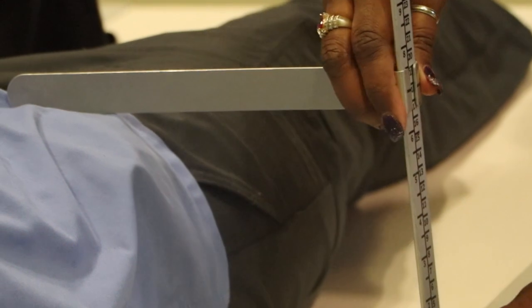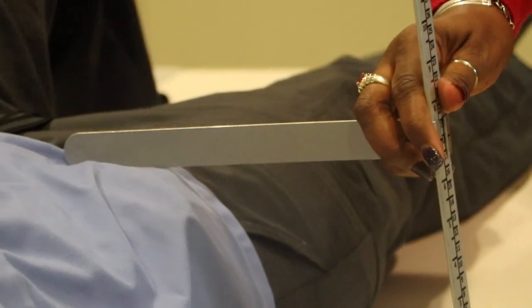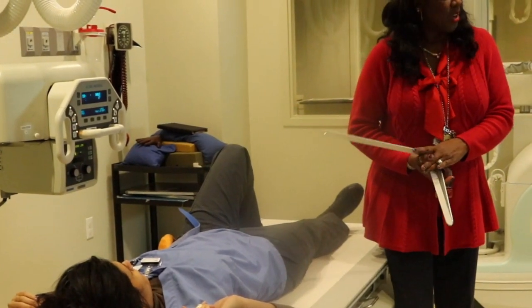And then you're going to read where this line comes across. Let me raise it up so that you can see. She reads at 18 centimeters, okay? So we're going to remember that. If it's 18 centimeters, what degree of angulation are we going to place on our central ray? Caudad tube angle of 3 to 5 degrees. So our patient measures 18 centimeters, and we have a 3 to 5 degree caudad tube angle on our central ray.